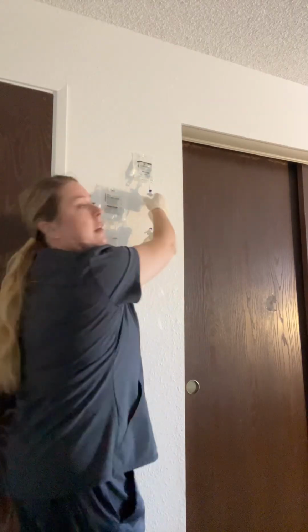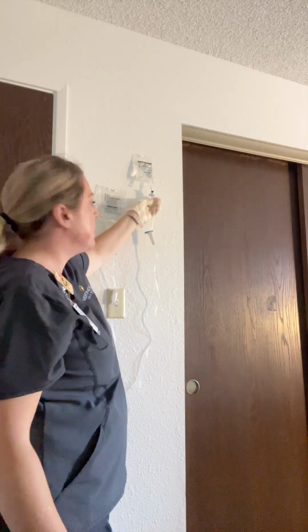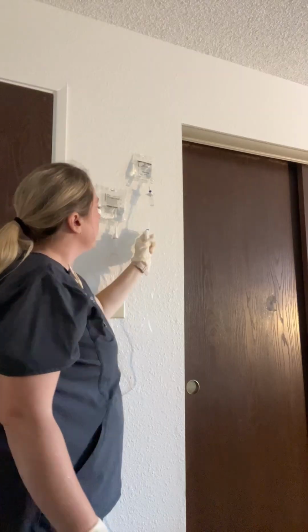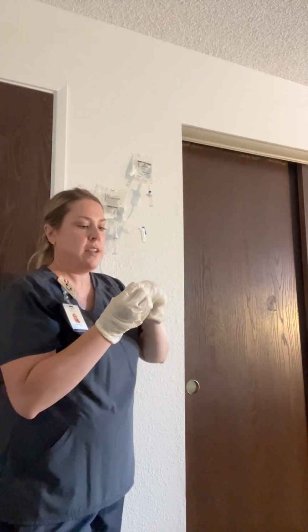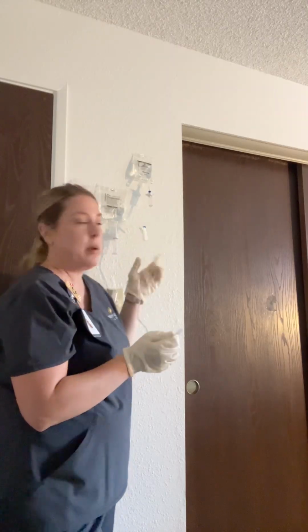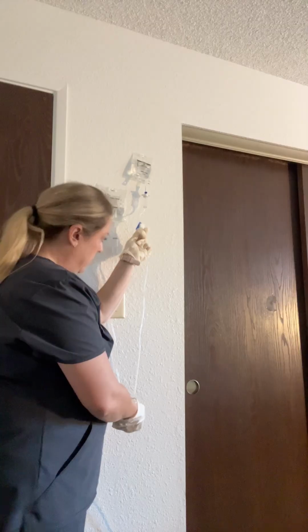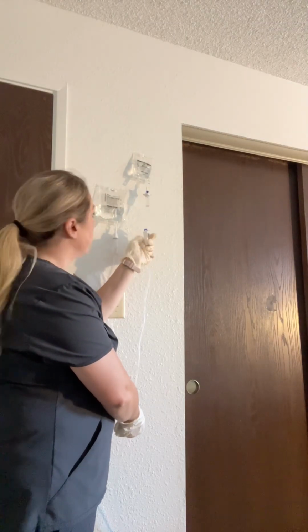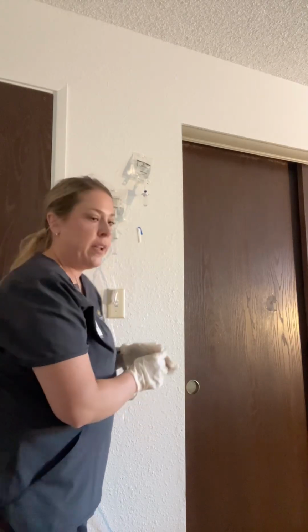Okay. Again, squeeze the drip chamber until it's half full, and then we want to slowly open our line. Slowly open up our line. Take out that adapter cap and just make sure that the air bubbles escape first. Okay, perfect.